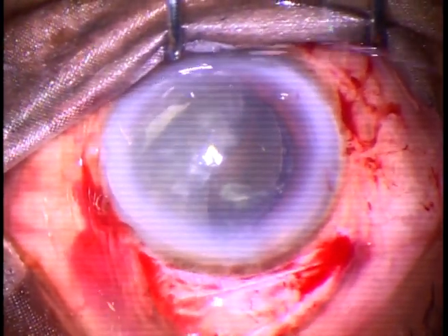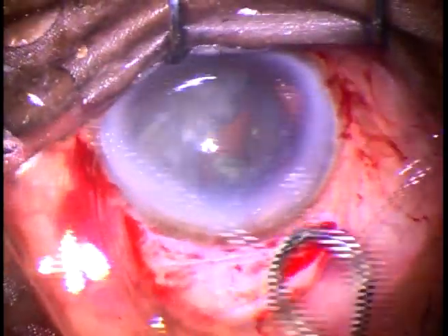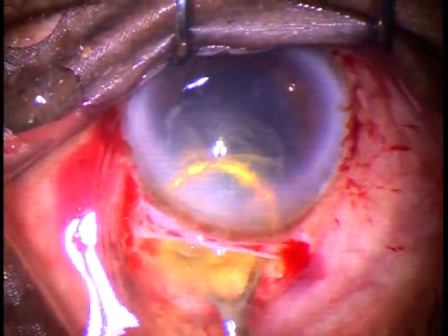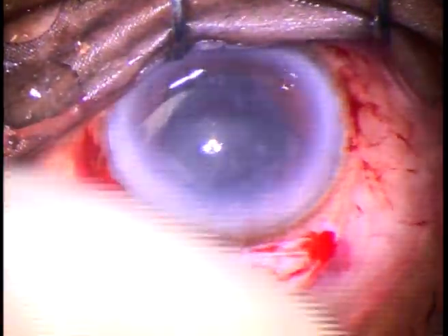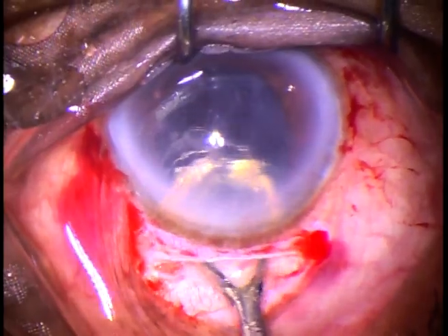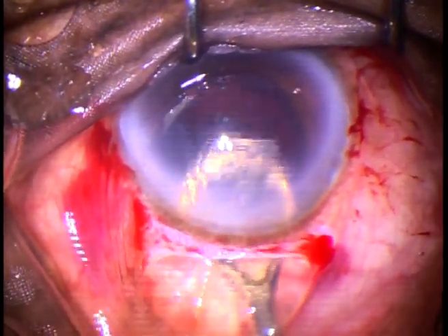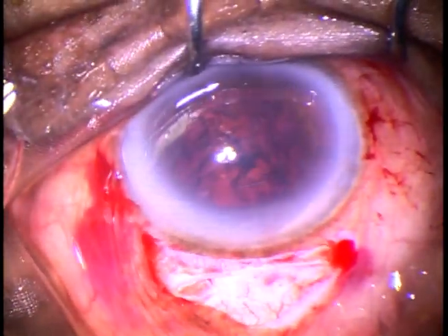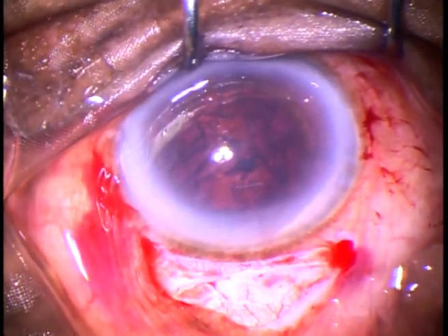And now, this is an irrigating vectus. See how smoothly we can deliver the nucleus. And now, a lot of epinucleus is there — it is coming out in this way. So, we have removed the nucleus and epinucleus.